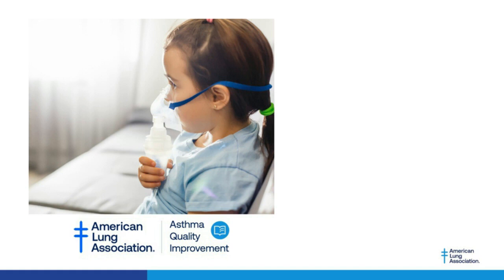So what we want to make sure is that the patient is getting bronchial dilatation. We watch the patient very carefully, make sure they're breathing in the med correctly, that they have a respective hold time of about 5 to 10 seconds. We wait about 30 seconds between each puff of the MDI. What we don't want is the provider to wonder, when seeing a bronchodilator study that didn't show any reversal, oh, I wonder if they got med. We want to make sure they got med.